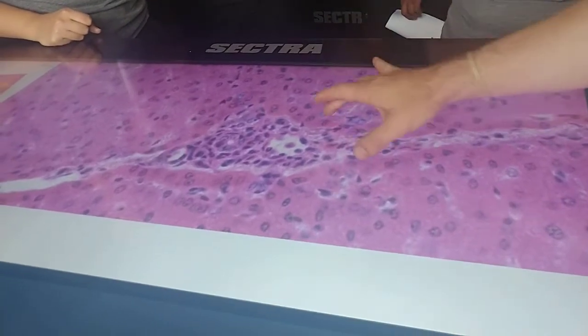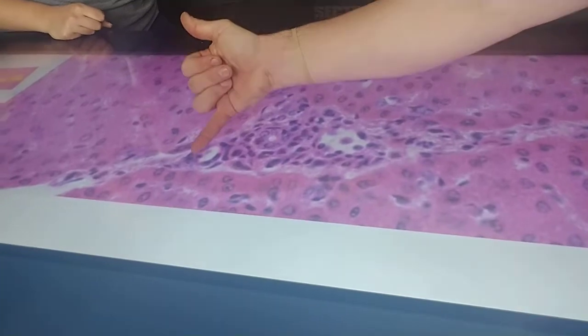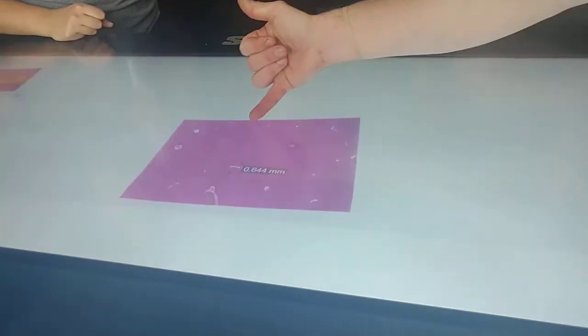So in comparing these, this guy here has a little bit of a smooth muscle wall, so that's my arteriole there.